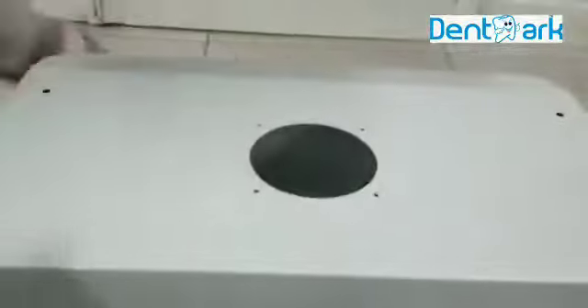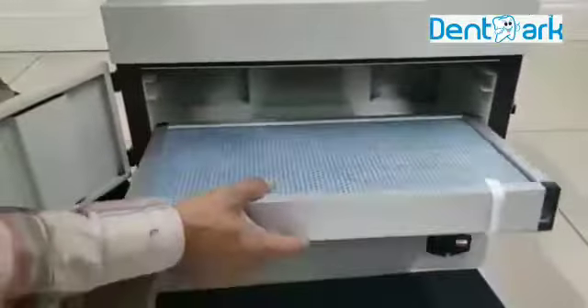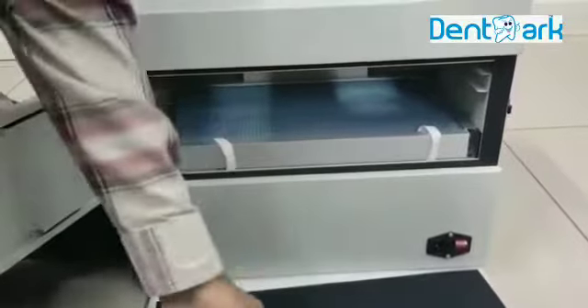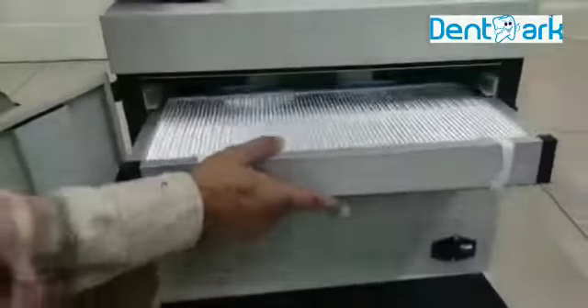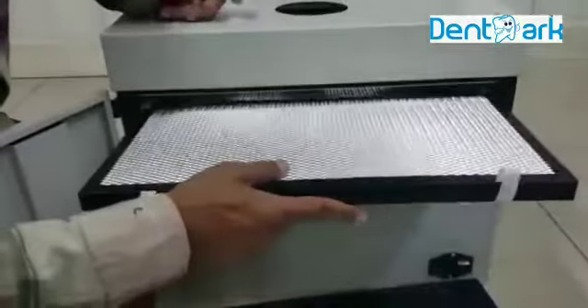After fixing the handle, put the filters again. This is the number one filter — this is heavy. This is lightweight. This is another filter. The third filter.